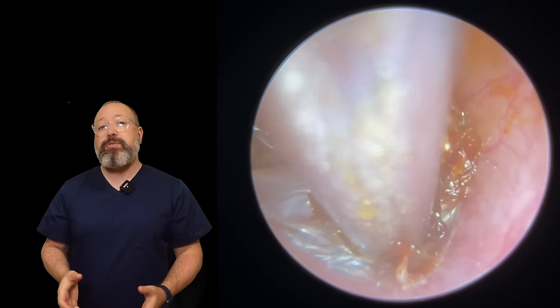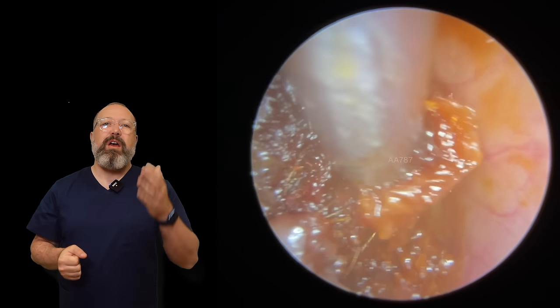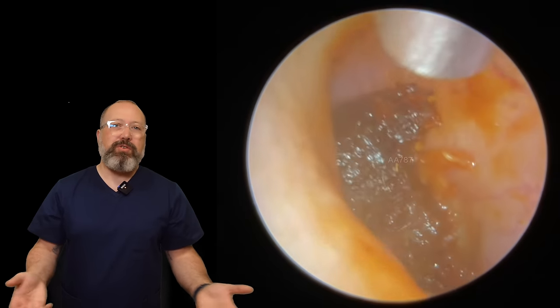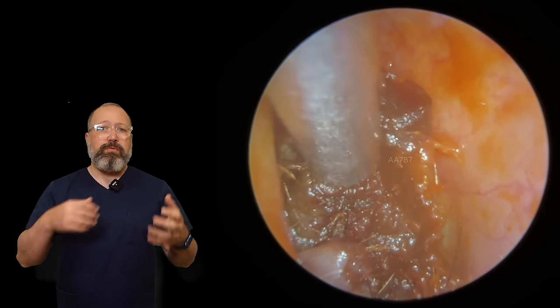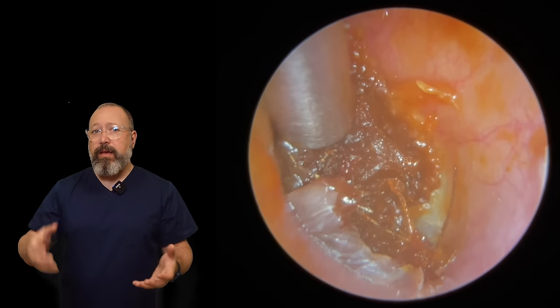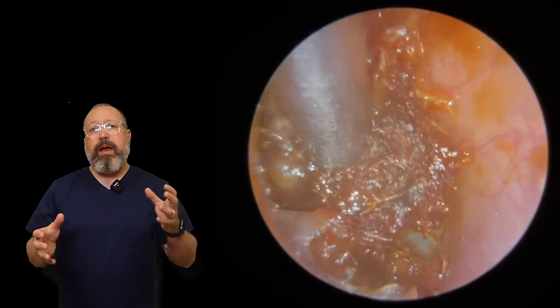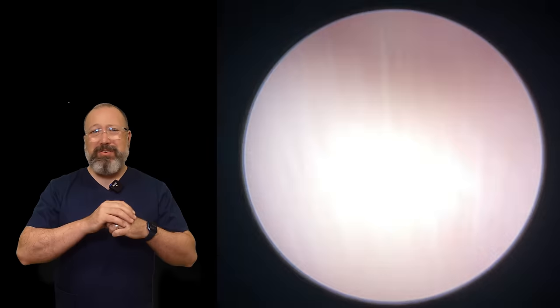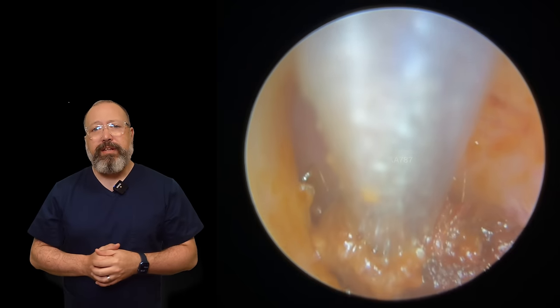Proportion-wise, this softer wetter mushier wax probably accounts for about 50 to 60 percent of the patients we see. Here in the UK we have the NHS so people get free medical provision, and a lot of people aren't used to paying for treatment. What they'll do is use every softening drop known to man to try and clear this out. Because the waiting times are a bit longer since COVID, by the time they get to us the wax is just everywhere, which makes it a lot harder to clear out.